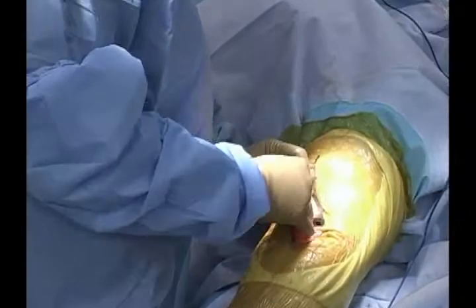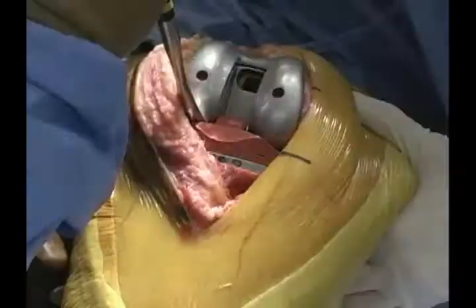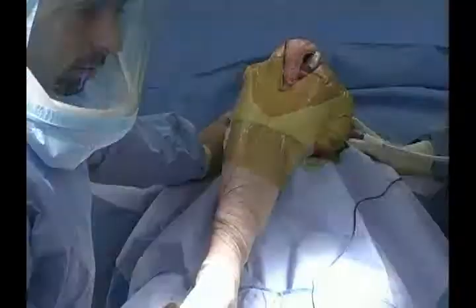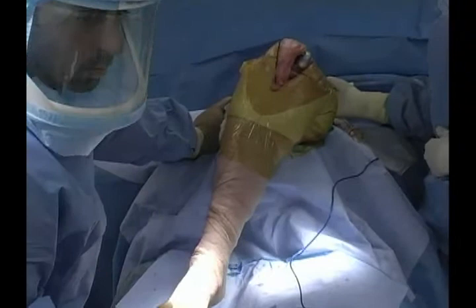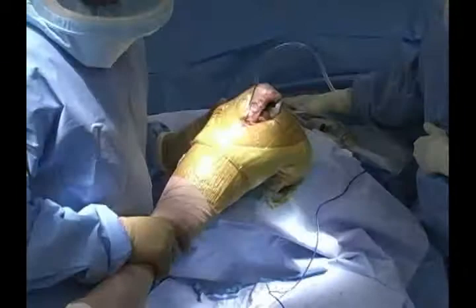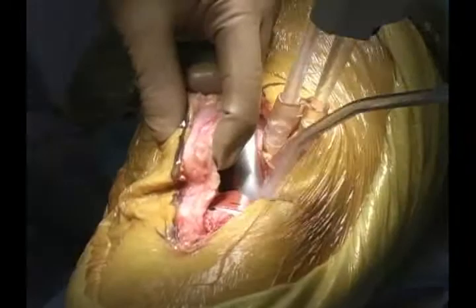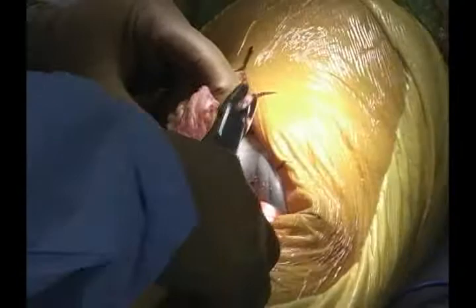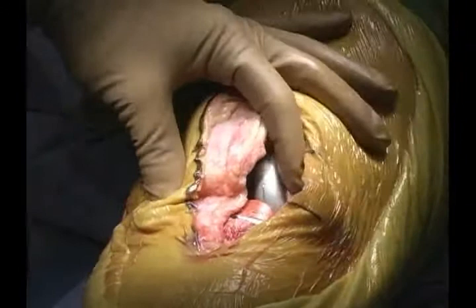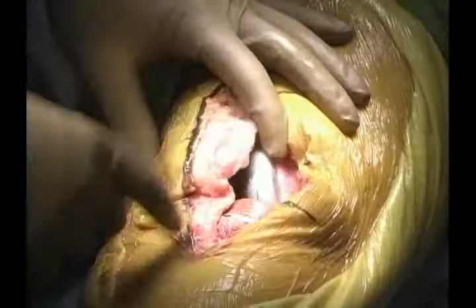We'll put the patella trial on and take the knee through flexion to assess patellar translation — about one to two millimeters laterally and zero to one medially. The knee flexes to about 125 to 130 degrees without any manual pressure; I call this the drop-and-dangle technique. Our flexion space is snug and balanced but not excessively tight. Since using the balanced resection technique, looking at our first 500 knees, I've done only two lateral releases — nearly zero lateral release rate — indicating that flexion space very accurately predicts femoral rotation, especially in valgus knees.